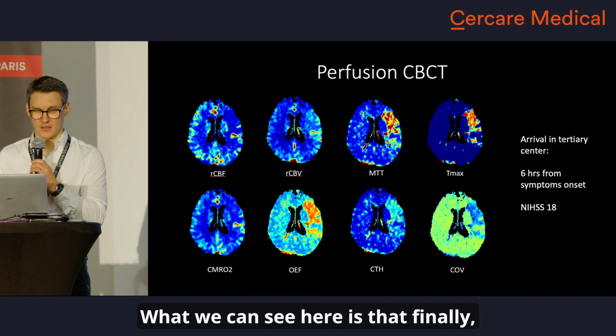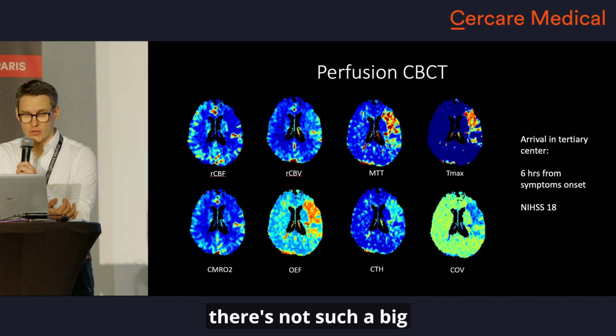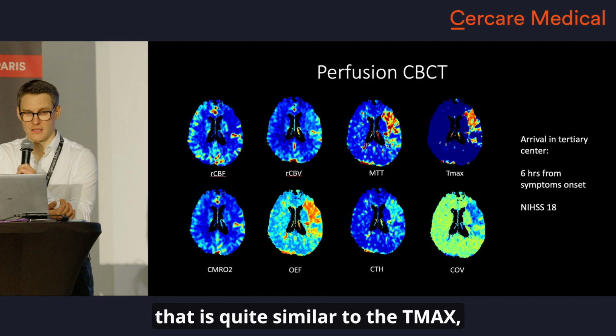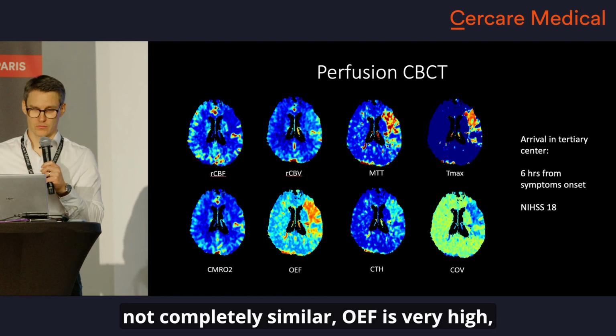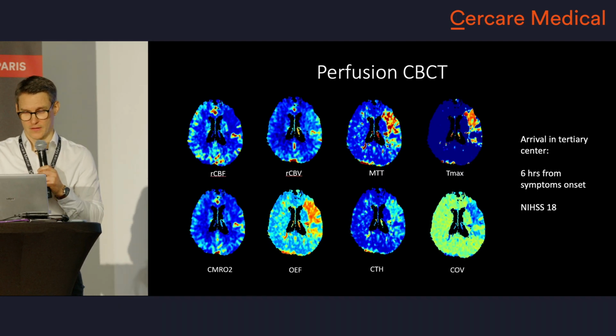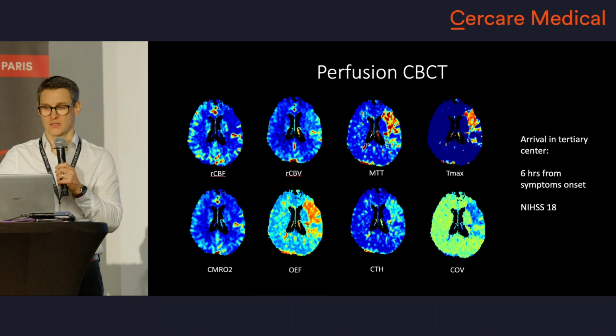What we can see here is that finally, there's not such a big mismatch, probably, with a CBF that is quite similar to the Tmax, not completely similar. OEF is very high. The patient is still at 6 hours from symptom onset with a very, very high disability.